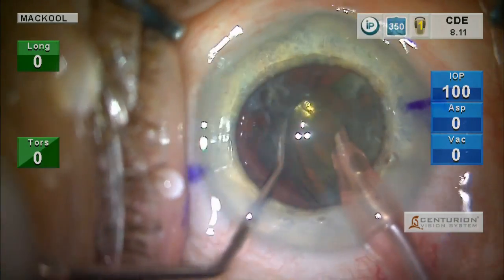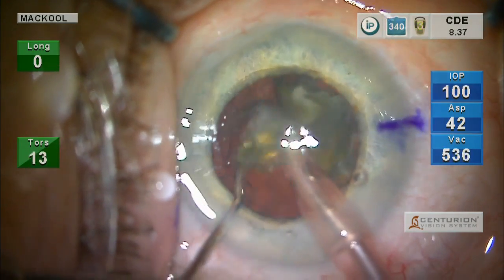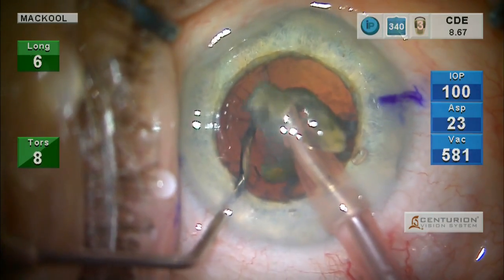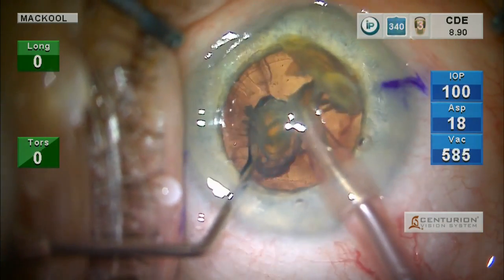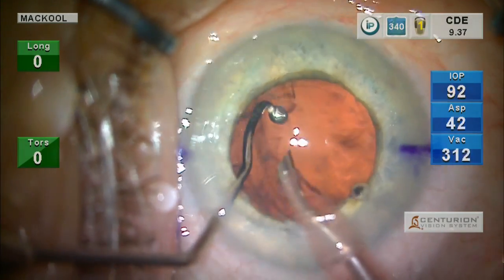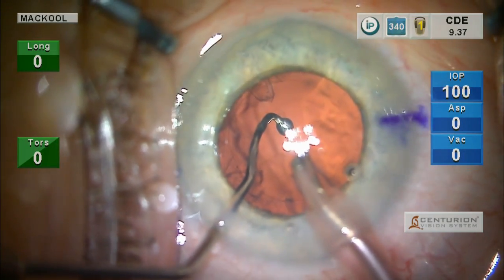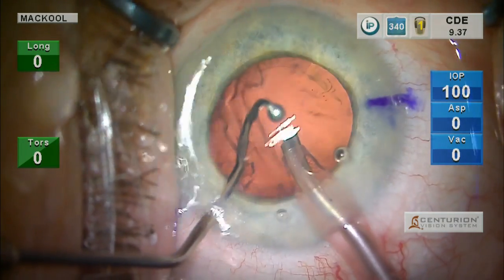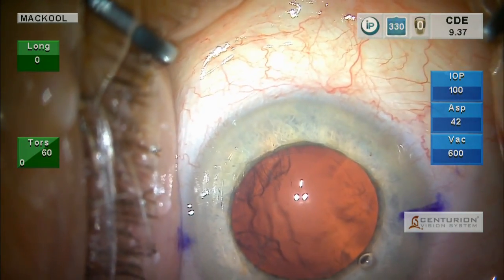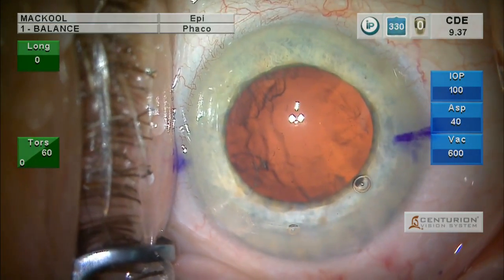When you see that intraoperatively, think that they may do that postoperatively. In other words, it may be a compensated dry eye syndrome. So that's the kind of case you might want to put on a lubricant, maybe 4 times a day, maybe after their steroid drop or their antibiotic drop. See how the cornea is dried out again? Wet the cornea. Good. So that's what we will do here. So sometimes you can head trouble off at the pass simply by what you observe intraoperatively.